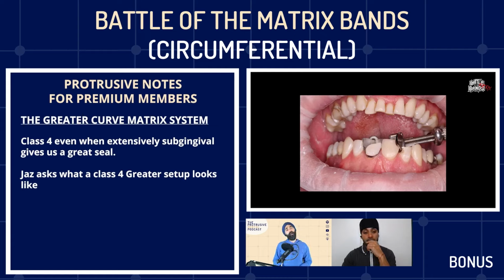I will show you that right now. Where is my image? There it is, on the left. So it wraps around, and what we do is we just cut some access. Ah, yes. You can imagine that's a very difficult situation to restore otherwise. So it kind of is like over-molding it and then getting your rugby ball at the end, getting the right contours. There's two types of people there. You're either a printer or you're a miller. So you're milling away the excess composite here to get the right shape. Yeah, totally. I think we're a bit of a hybrid, but certainly correct.